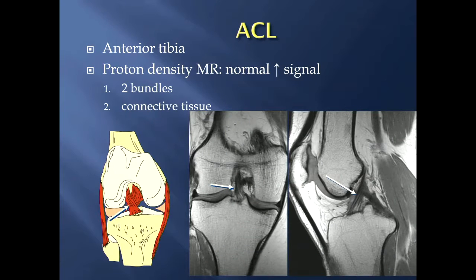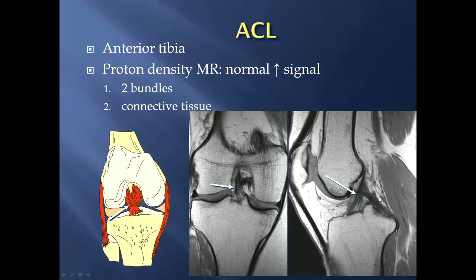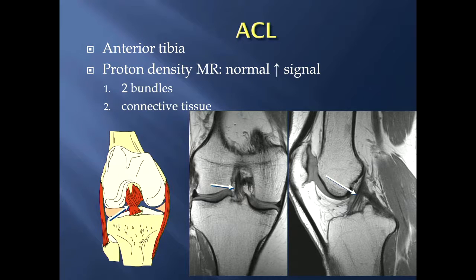Starting with the ACL, it's called the anterior cruciate ligament because it's positioned more anteriorly. Notice on the sagittal proton density image that the majority of the ligament is anterior to the PCL, and for its insertion onto the anterior portion of the tibia. On a proton density MR image — one of the most common pulse sequences in MR of the knee — it normally has increased signal within it, mostly these striations, and that is due to two reasons.